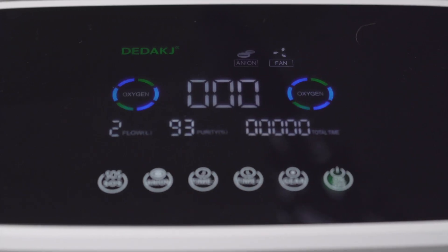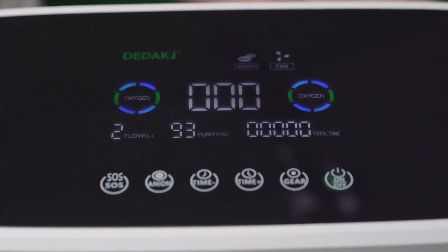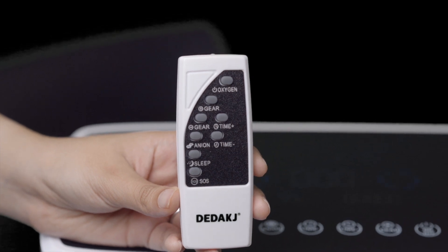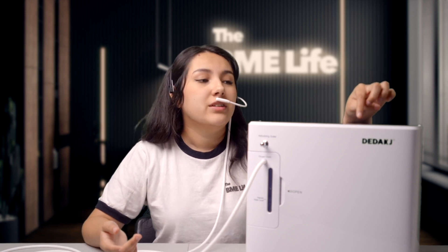It has an on/off button on the top — just click it and that's pretty much it. It has other buttons as well: you can adjust the timer, for example setting it to run for 30 minutes or an hour. You can also adjust the flow using the gear button. The lower the flow, the higher the oxygen purity; and the higher the flow, the lower the oxygen purity. So once you're ready to use it, just turn it on and adjust the flow to whatever rate you want.